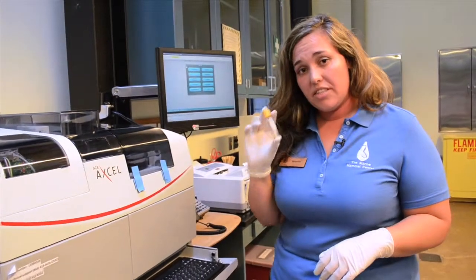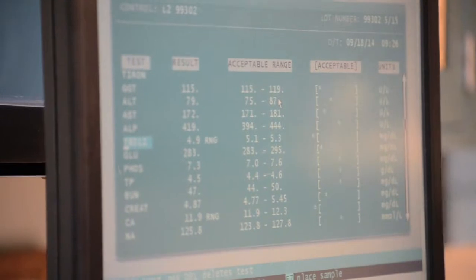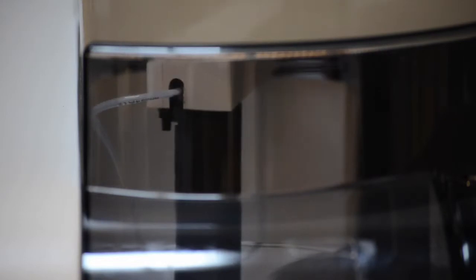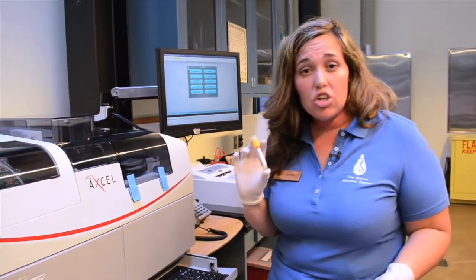Now that we've separated out the serum from our blood sample, we're going to place it in this body function machine. The body function machine is going to tell us all sorts of things about what's going on within our patient's body — that includes how the liver or kidney is performing, are they dehydrated, malnourished, what are their blood sugar levels.